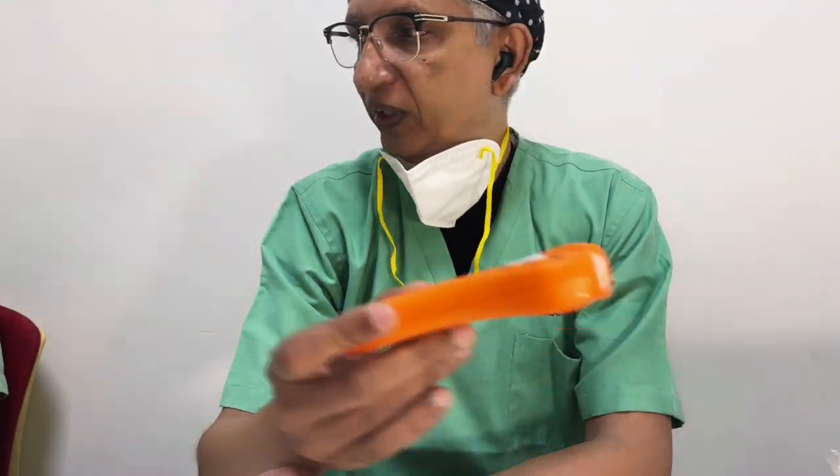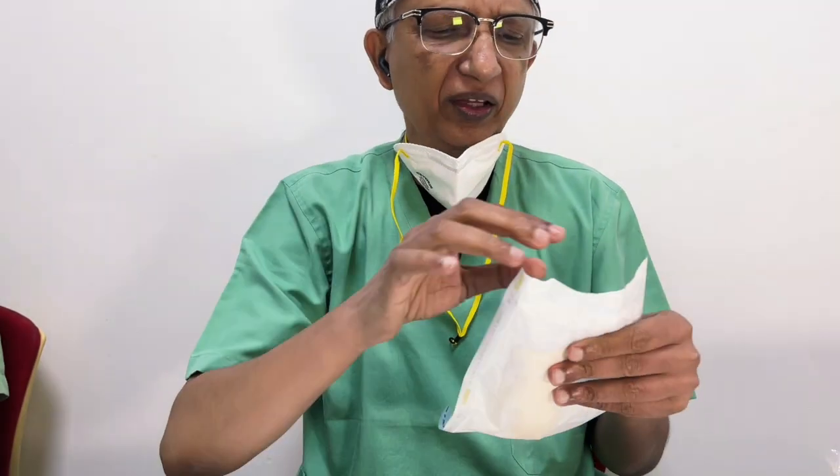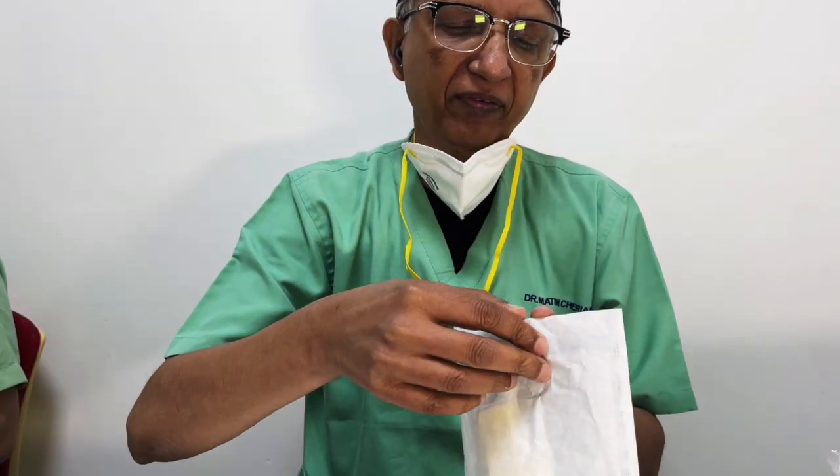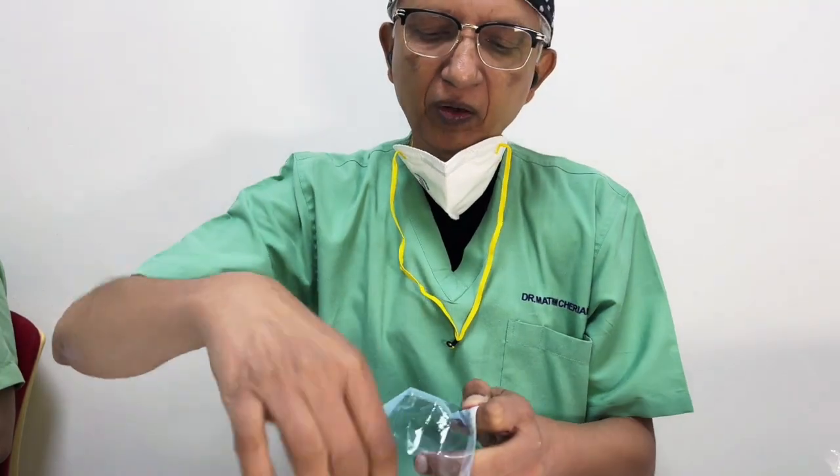The only problem with the Barricade is that the detachment has two wires to put in, which is an older detachment system. On the other hand, all these cables are there for using the Barricade system. Whereas with all the other coils, it is a simple handle device like this. This is called the InZone detachment system. This is for Stryker, and we have detachment systems like these. This is a detachment system that works with a MicroVention coil. All of them work on the same principle. You insert the wire coil, a light will light up, press the knob, and it will detach.